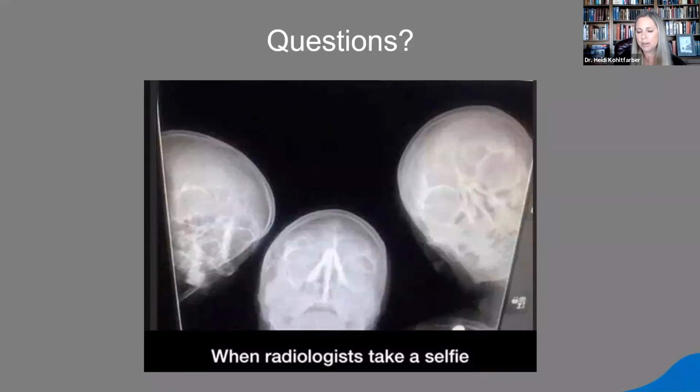Very, very rarely do we ever see a case where the person gets in trouble because they took the CBCT and didn't know how to read it. I think there's maybe only 1 or 2 instances that I know of personally, and in those cases, it was blatant. Like, for instance, an implant placed right in the middle of an osteosarcoma. Something we probably should have seen. It's in our arena. So I think from that standpoint, you can feel very good about taking your scans, but we do need to look through them.